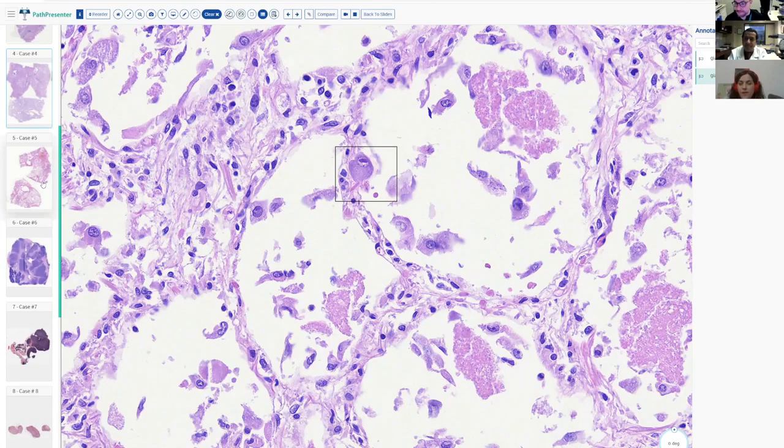Actually, the tweet I made was that two of the patients had AIDS, the one with the pneumonia and the one with the granuloma. But the one with the granuloma had recovered, did not have the low lymphocyte count that you need for having the pneumonia, and was feeling well. My impression is that his immunity was enough to make the granuloma, to make that reaction. Yeah. Cool. And the other case, the diffuse alveolar damage, is an oncologic patient. It's another kind of immunosuppression, not that big.